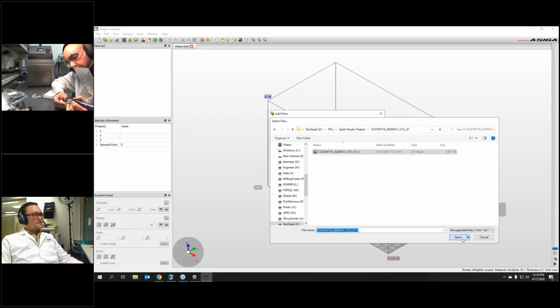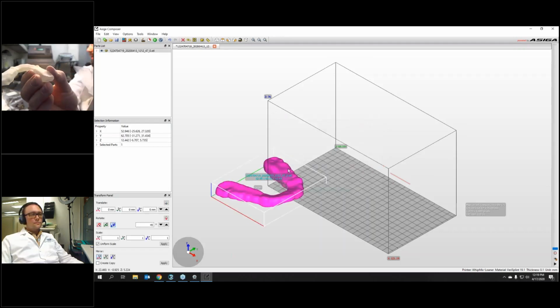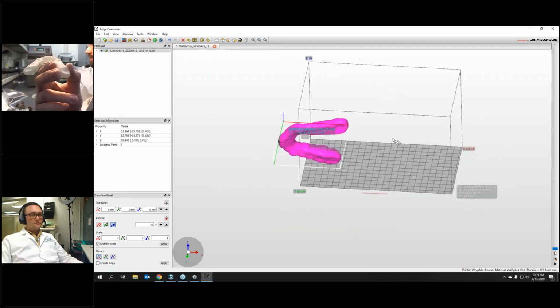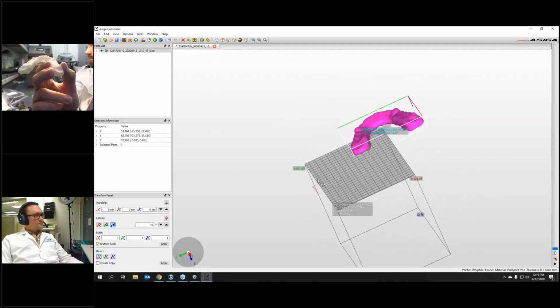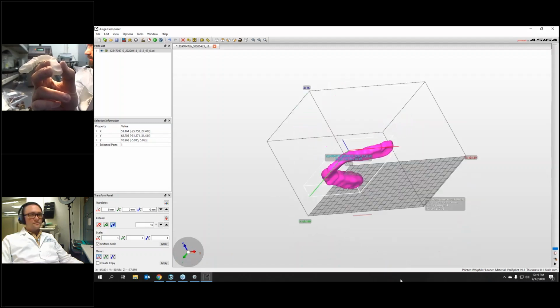And you could also see when he was showing that occlusal surface, you can still see all the contour of the ramps and everything that we put in the software. So it's really just knocking off those surface supports. Let me see if I can get a good view of that. Yeah, so you can see all the contour. And if you look at the screen that Evan's got right now, yeah, go and flip it over, you can see this is the same splint. Yeah, so you can see all the same contours.